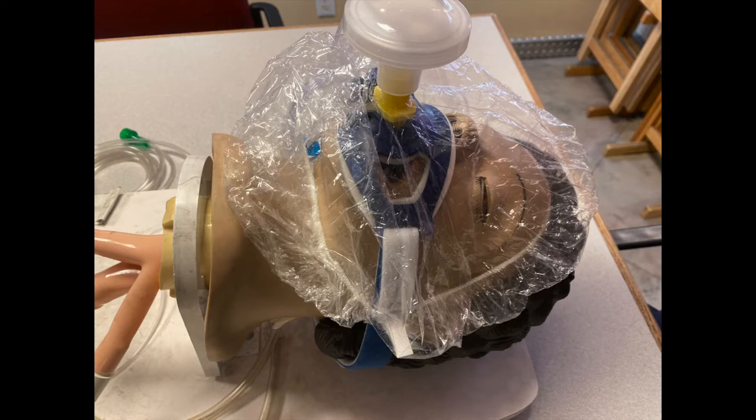If you're concerned about the shower cap moving, you can take some transport tape and tape it down to the patient's face. The good news is that the shower cap isn't going anywhere because it's held in place by the BVM and the distal end of the tube, so it's not going to fly off if it gets windy or if you're moving.